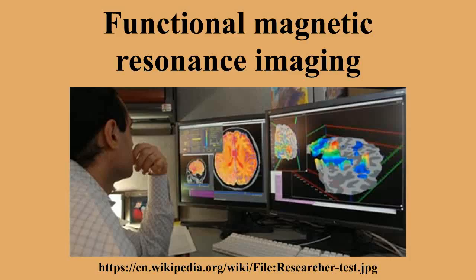Animal research. Research is primarily performed in non-human primates such as the rhesus macaque. These studies can be used both to check or predict human results and to validate the fMRI technique itself. But the studies are difficult because it is hard to motivate an animal to stay still, and typical inducements such as juice trigger head movement while the animal swallows it. It is also expensive to maintain a colony of larger animals such as the macaque.